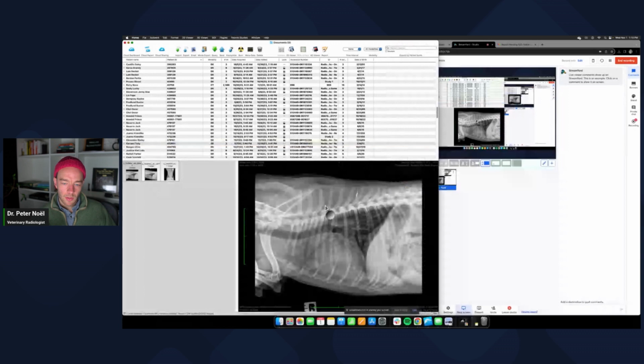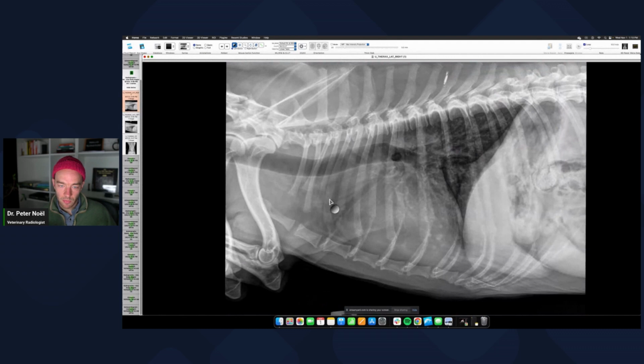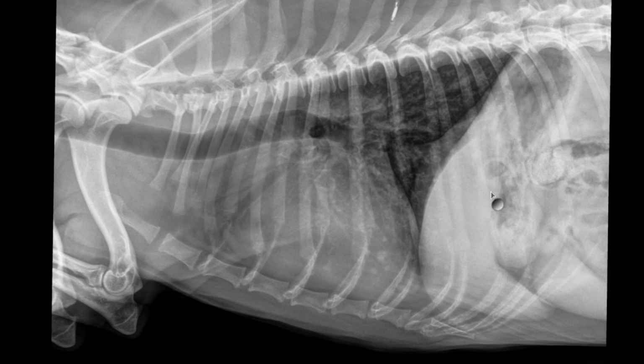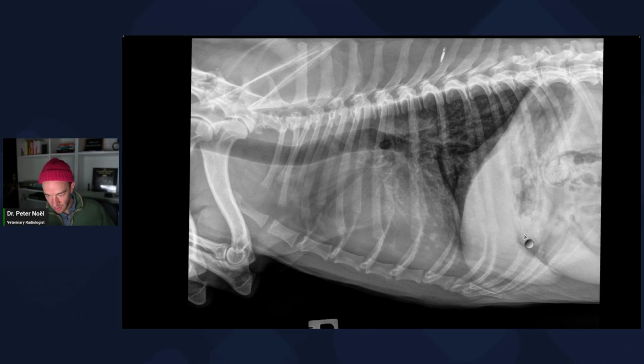have uniform size. So this is the case that we discussed in episode 5, and there's a cluster of pulmonary nodules overlying the cardiac apex on this lateral view. You'll see them right here. Without going into the entirety of the case, I suspect that these are soft tissue opaque pulmonary nodules and they're metastatic. The reason, in clear distinction from osseous metaplasia, is that they are variable in size. So they're soft tissue opaque and they're variable in size.